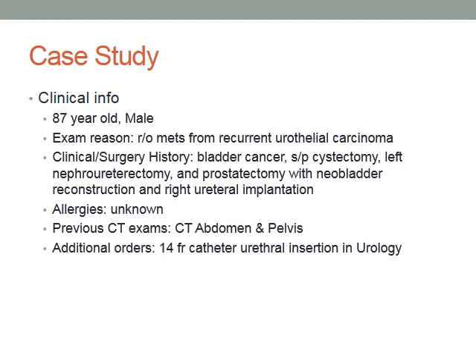I do think an MRI urogram would not be appropriate for this study because the patient would have to drink a lot of water to distend the bladder, and that would take a lot of time to fill. Also, IV contrast must be used as well. Additional to the longer exam times of an MRI, a full bladder would not be very comfortable for the patient.